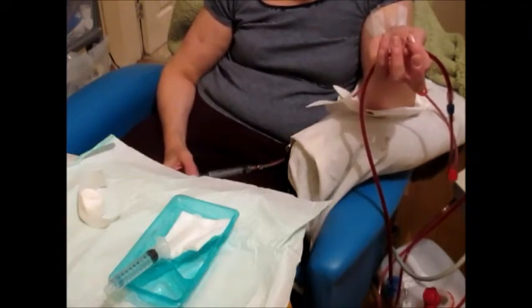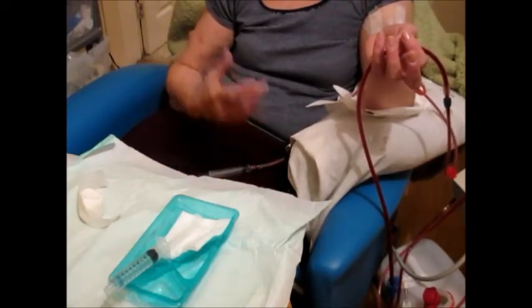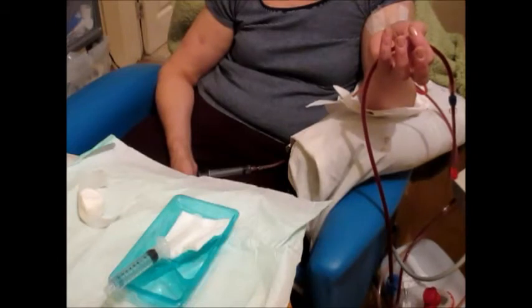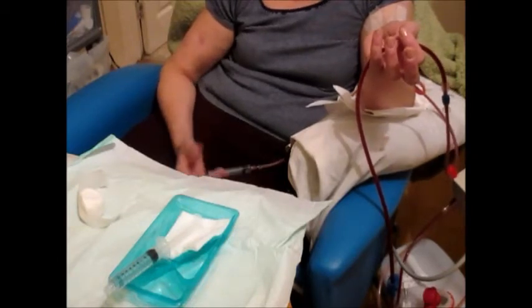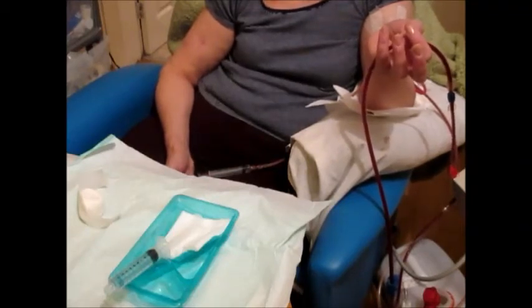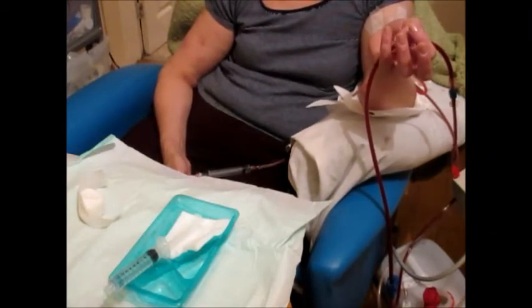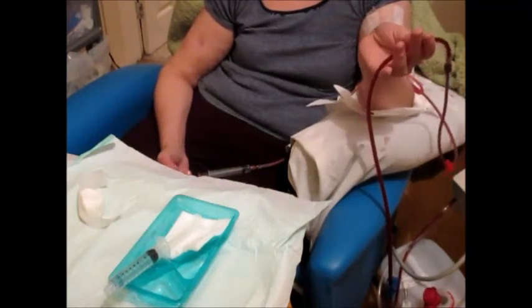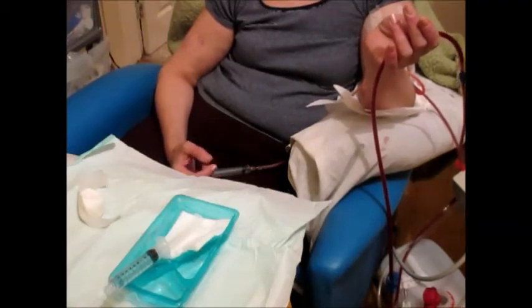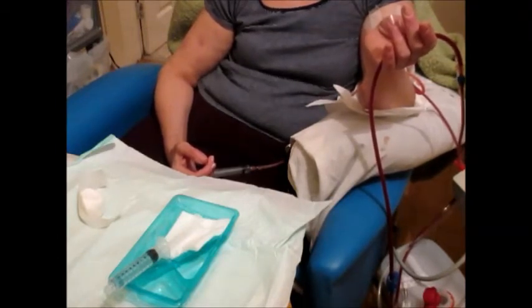There's some debate about the washback amount. During training the nurses wanted to wash back about 360ml of saline, but I've always found that 300ml is enough for me — because obviously you don't want to overload yourself with fluid too quickly. So it's a fine balancing act. The machine shows how much fluid is being washed back.